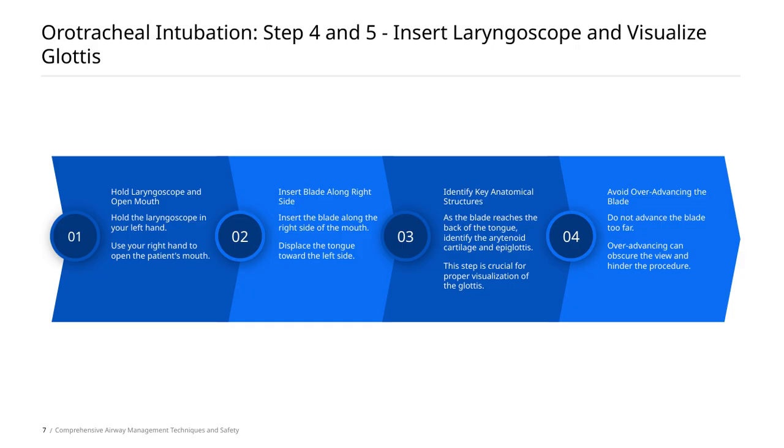Recognizing these structures is essential because they guide you to the glottis, which is your target for intubation. Remember, this step is crucial for proper visualization of the glottis, so take your time and be precise.